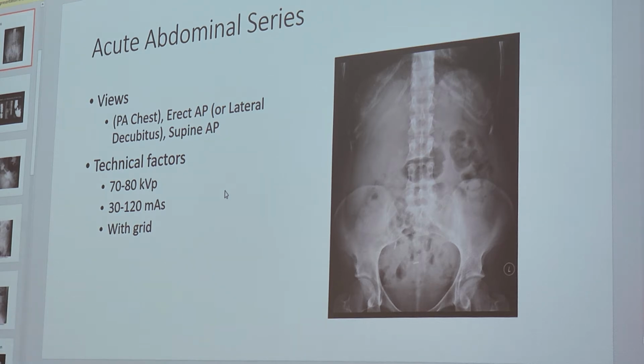That tells you you have a chest X-ray, an upright abdomen, and a supine abdomen. The idea is that some pathologies do not require the patient to be upright. All we need is the supine KUB, and we can see what we need to see. Some other things will benefit from the patient being upright, so we do one image with them up and one image with them supine.